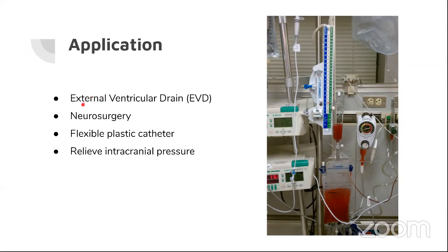EVD, also called external ventricular drain. As you can see in the picture here, it is a neurosurgery that places a flexible plastic catheter, which reduces the intracranial pressure by draining the fluid from the ventricles when the normal flow of fluid inside the brain is obstructed. By making an automatic MRI segmenter, this project is beneficial for enhancing the operability and accuracy of EVD. Next, I will talk about data collection.